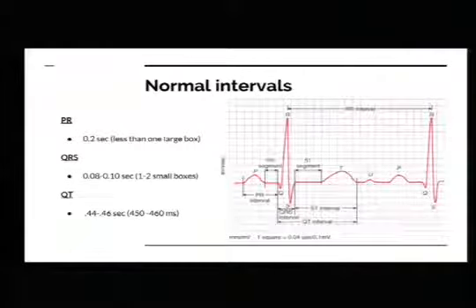So often you look at your 12 lead and say, that doesn't look quite right. Something's longer than it should be, and that's when the computer will calculate for you. You shouldn't have to be calculating your own intervals. The monitor will do that for you.